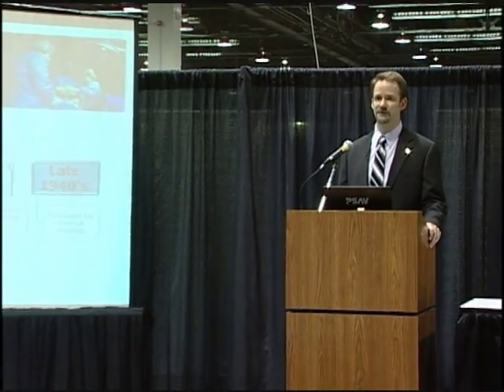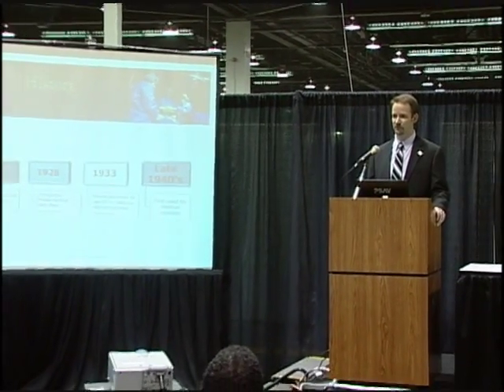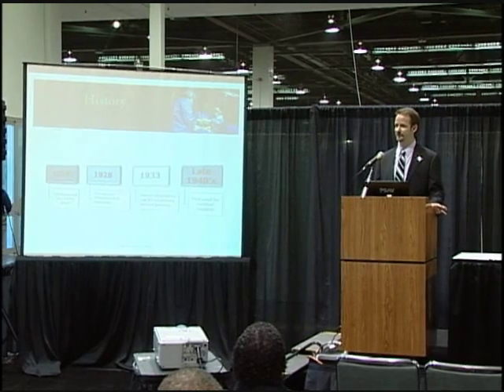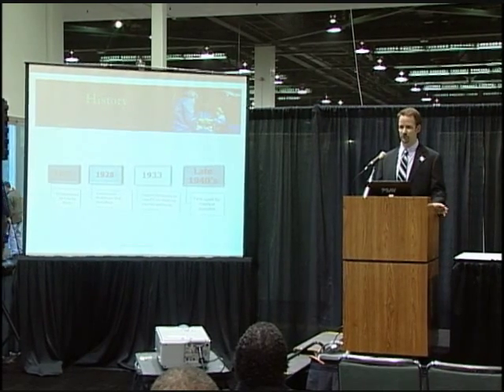And then it was the late 1940s before it was first used for medical supplies and instruments. And that process really hasn't changed much to what it is today. There have been some technical advancements, but the main process is fairly similar. And why we bring these dates up is because ethylene oxide has such a long history of successful use, it gains wide regulatory acceptance. So the FDA is very familiar with it.